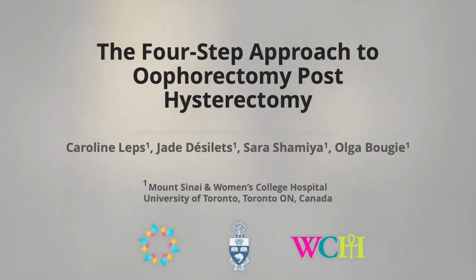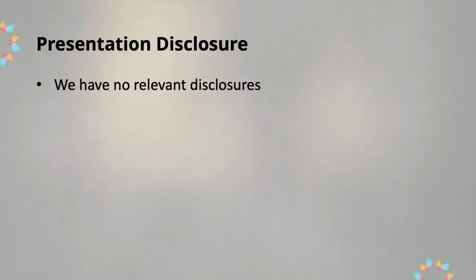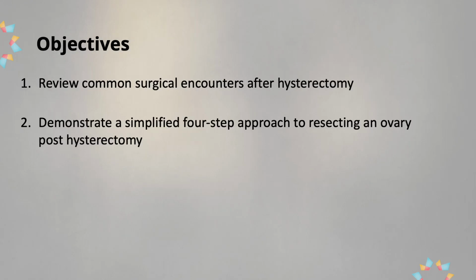The four-step approach to oophorectomy post-hysterectomy. We have no relevant disclosures. The objectives of this video are to: 1. Review common surgical encounters after hysterectomy, and 2. Demonstrate a simplified four-step approach to resecting an ovary post-hysterectomy.